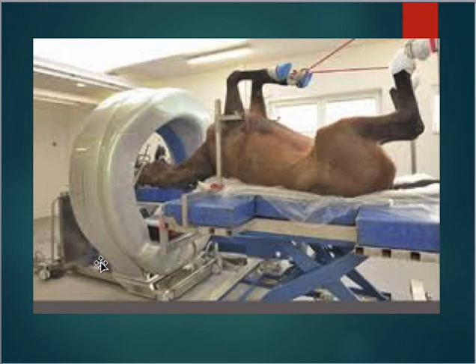Another veterinary scanner. So obviously you can see here this opening is much bigger and this table is going to be able to hold a lot more weight. So that's why we would send a patient to a veterinary hospital if they weren't able to fit through our scanners.